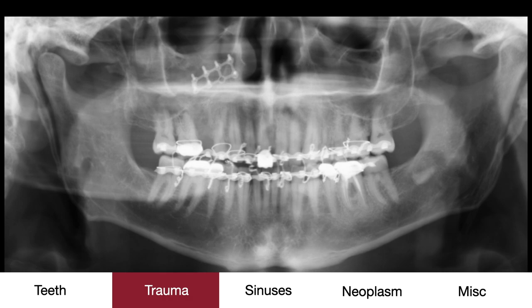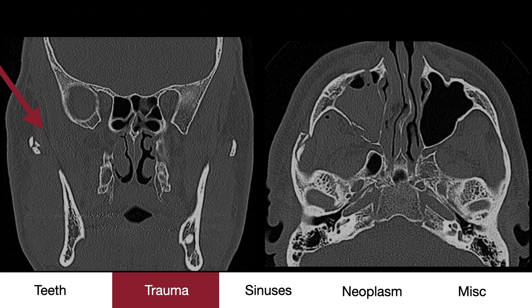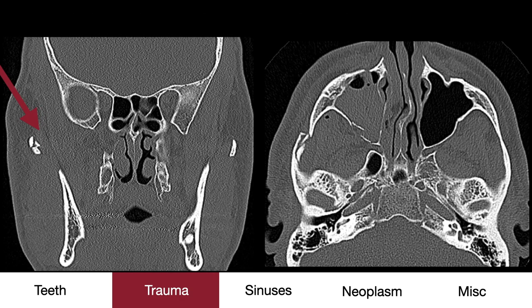We see extensive dental hardware over both the maxillary and mandibular teeth, and also this unclear radiopaque structure overlying the right maxillary sinus. When looking at the bones, we see an asymmetric right zygomatic arch relative to the left. The left side is what an arch should look like, but instead the right side was fractured.